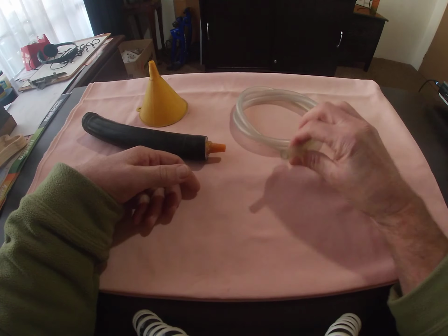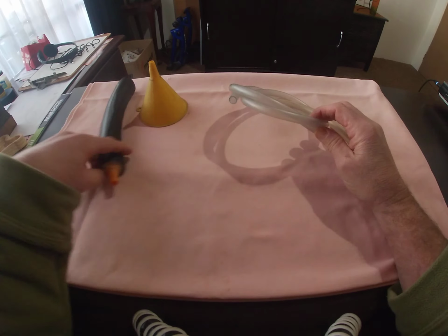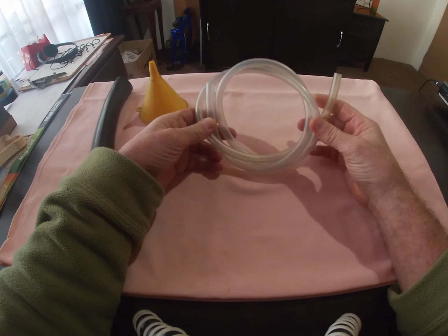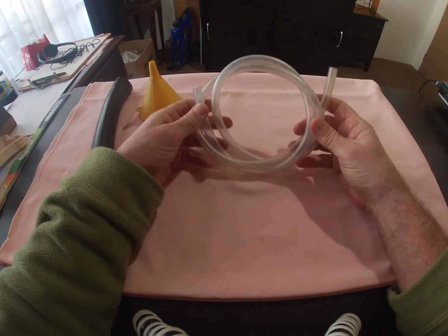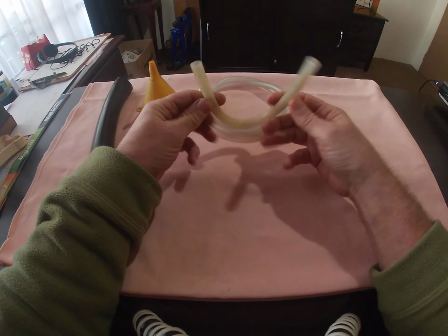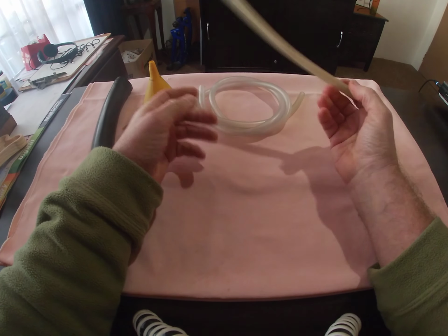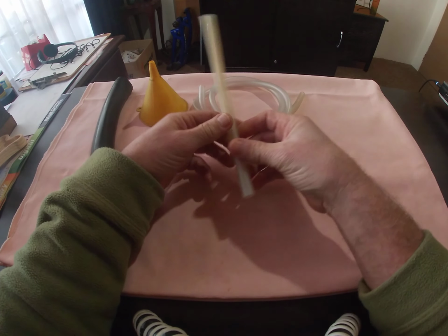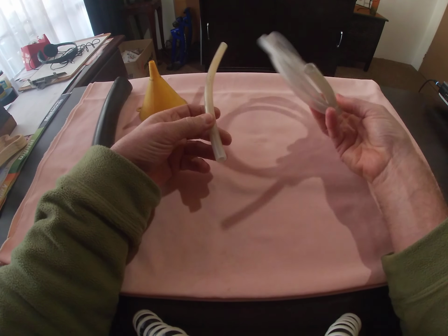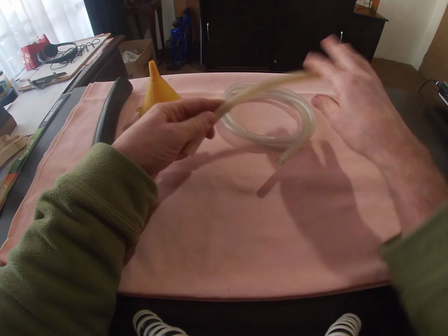Some tubing, you can also buy from the hardware store. They use them for koi ponds, or little fountains that you find outside in the garden. I have some silicone tubing on hand, and this is the type they use in hospitals, and I prefer this. If you can get your hands on them, they're very flexible and they've got a better feel to them, whereas this is just really cheap, solid. But if you don't have anything else, this will work fine.